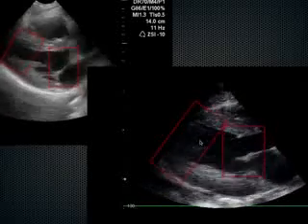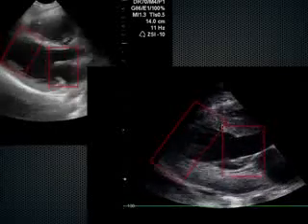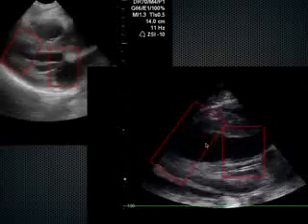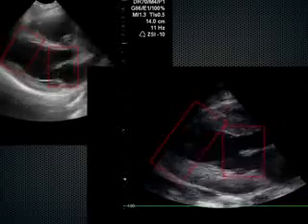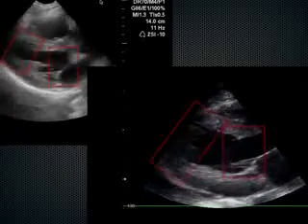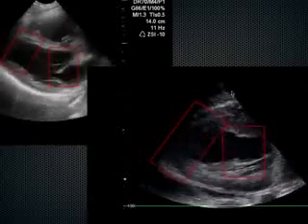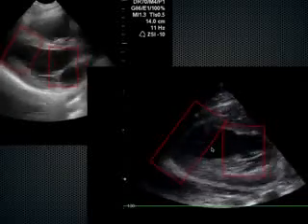Down here, though, we've got a couple problems. First of all, this mitral valve is not coming anywhere near that septum. Number two, the interventricular septum and posterior wall are not squeezing the red blood cells out of the aortic outflow tract. So just right off the bat, if both these patients had a blood pressure of 70, I'm going to give this patient fluids, and this patient, I'm going to be very careful with fluids and likely lean on inotropic therapy.